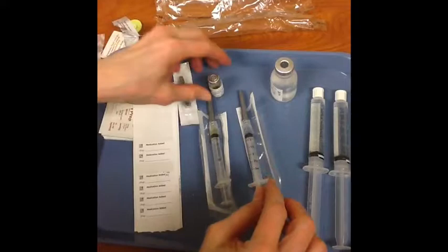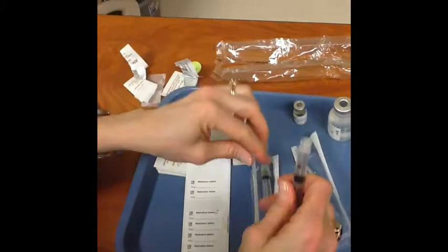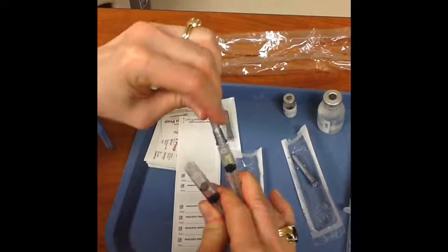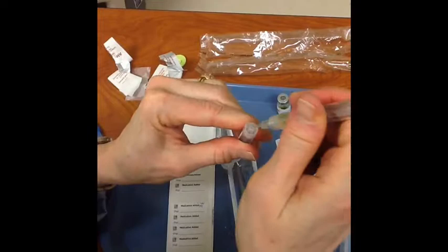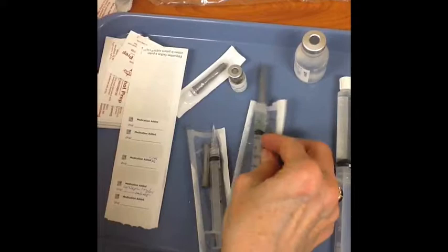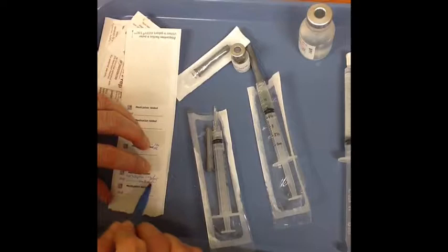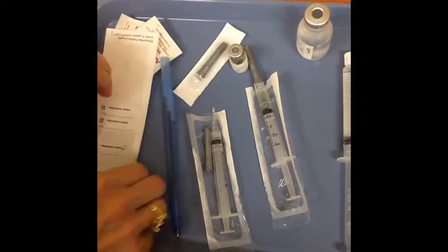Now I'm going to make room in the saline syringe for the drug. I pull a little more than I need, leave the smart tip on that syringe, pull the other smart tip off, and press the Ativan syringe's tip right into the saline syringe to combine them. Push the drug in. Now I'm going to label the syringe: lorazepam 1 milligram, because 0.5 mils is 1 milligram of lorazepam, and I've got 0.5 mils of normal saline. Make sure I don't cover up the increments so I can see what I'm doing. It's ready to go.